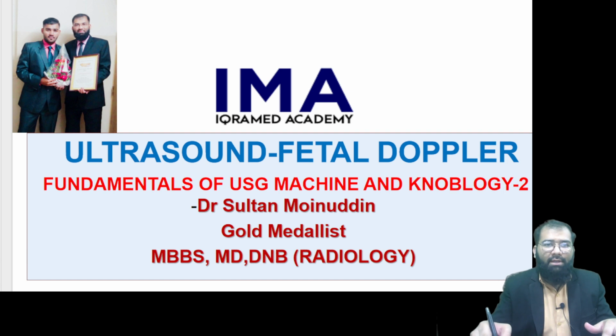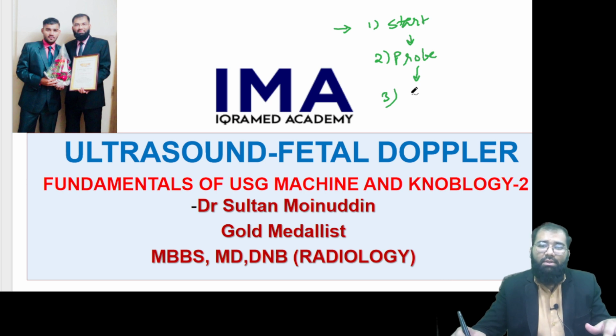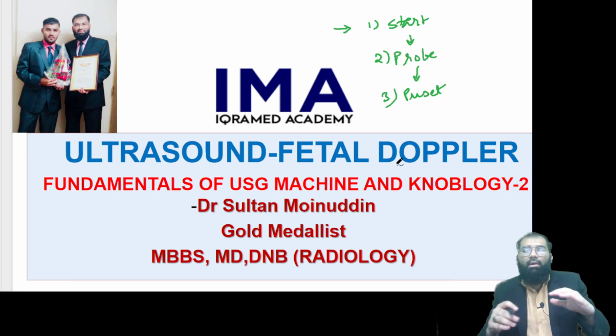So number one, you have to start the machine. Number two, you have to select the right probe, which is the convex probe in case of an OBS scan, OBS Doppler scan. And third, very important, is you have to select the right preset. So this is how we start, and now we are moving ahead.